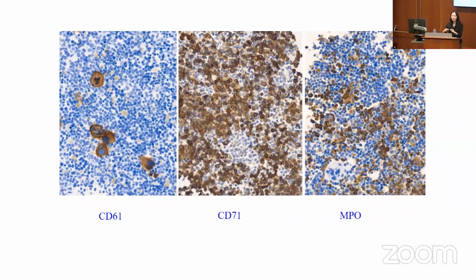The technologists for immunohistochemistry actually have these different bins and they label it separately. Plus, I can tell because of the cell morphology that these, for example, are megakaryocytes. And the label of this immunostain, CD61, is a megakaryocytic marker. CD71 is transferrin, which is on erythroid progenitors. So you can see my erythroid progenitors are positive for it. It actually doesn't stain plain old red blood cells, which is nice because I don't want to see it being like an artifact on the slide.